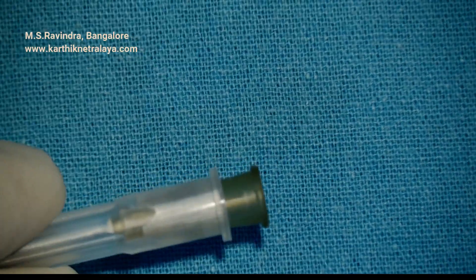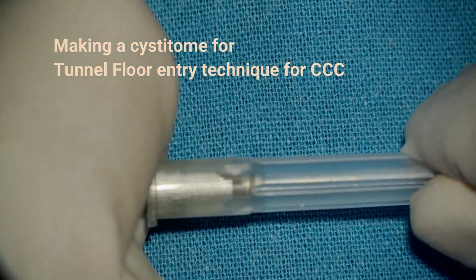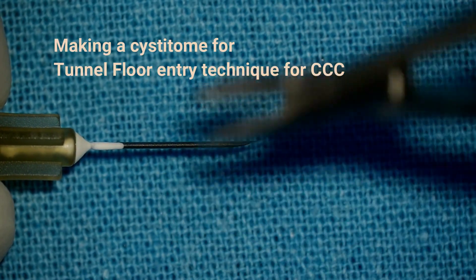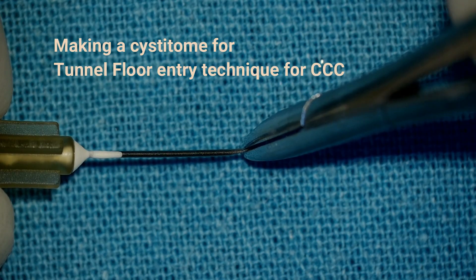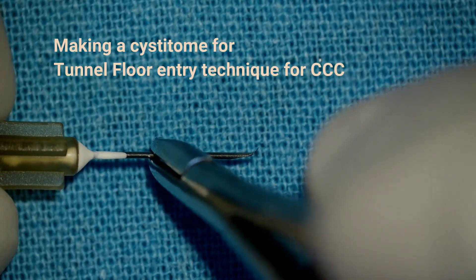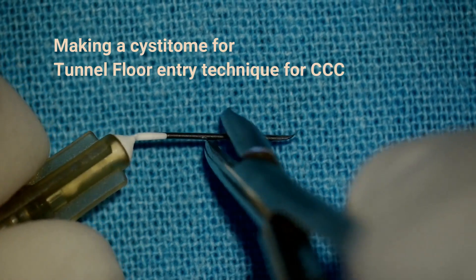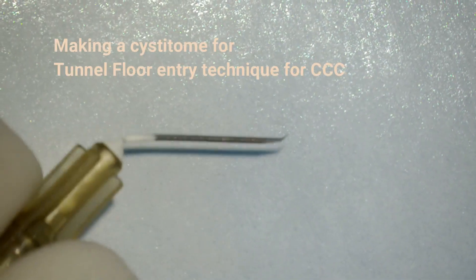For the tunnel floor entry technique of cystitome, creating a CCC, the needle tip has to be extremely sharp. When you remove the plastic sleeve, take care that the tip is not touched against the wall of the sleeve. The needle holder should travel from the base of the needle and grip the tip exactly at half of the bevel, and then the entire needle is bent by about 45 degrees. Note that the tip is not bent to 90 degrees — it's bent to 45 degrees, and the shaft is also bent to 45 degrees from the plastic hub.